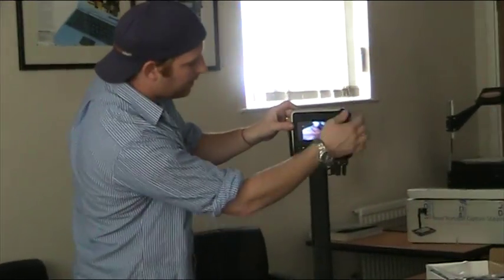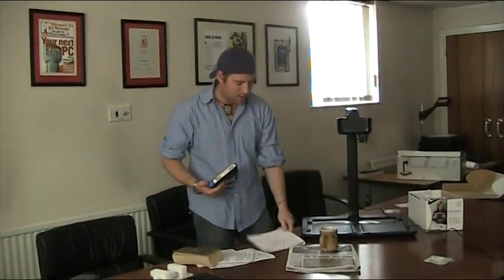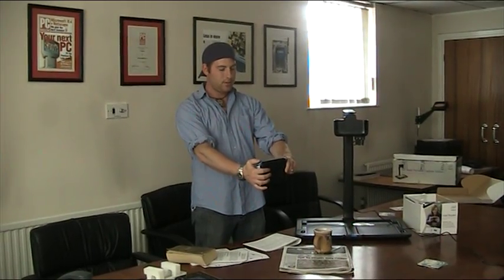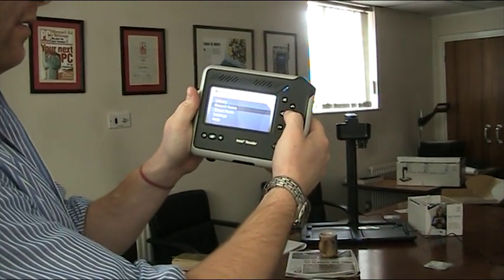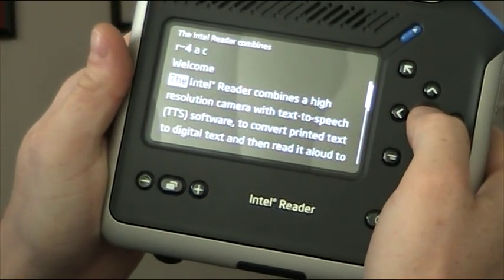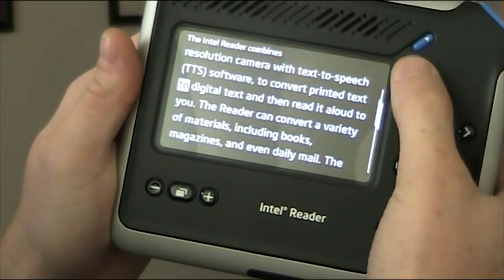I just went ahead and unplugged everything and pulled it out. The best thing about this device is that it's portable — you don't always need the stand. It does cost 995 pounds, effectively taking the place of your laptop. We'll just go ahead and pick a random piece of paper to see how a normal individual would do it when they want to snap and have something read back to them. The Intel Reader combines a high-resolution camera with text-to-speech software to convert printed text to digital text.